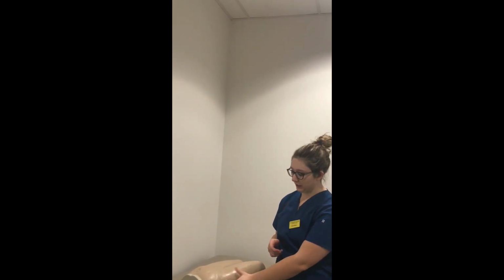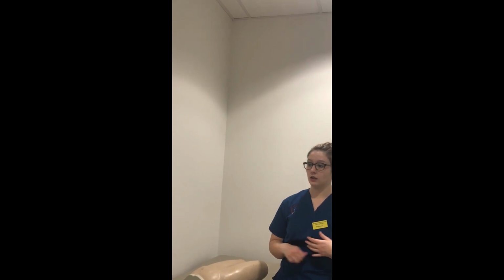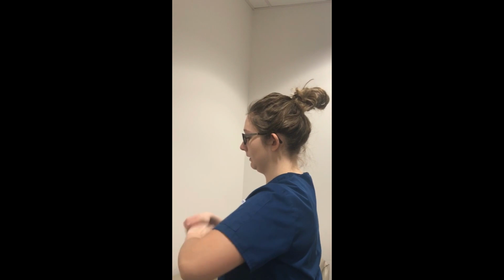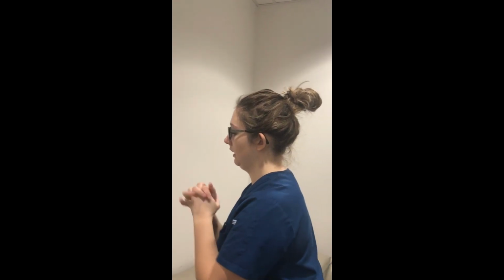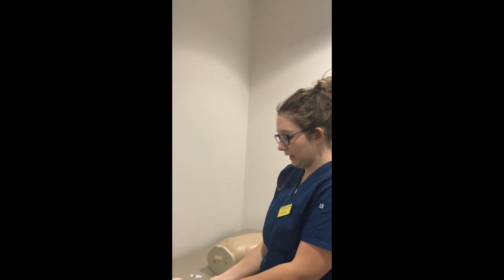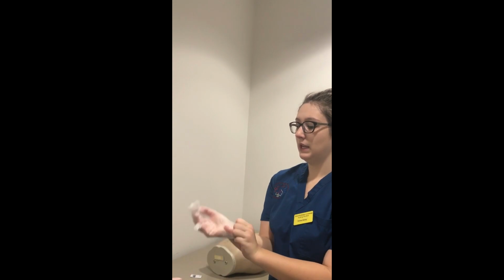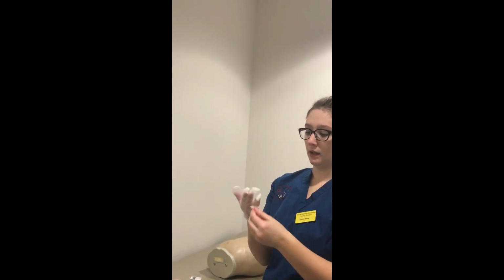So just the way I spread my fingers, it's going to be moving the muscles, and then I will be giving the injection at a 90-degree angle. So I will perform hand hygiene and put on gloves. It's not a sterile procedure, but it should be aseptic, so I will be using clean gloves.